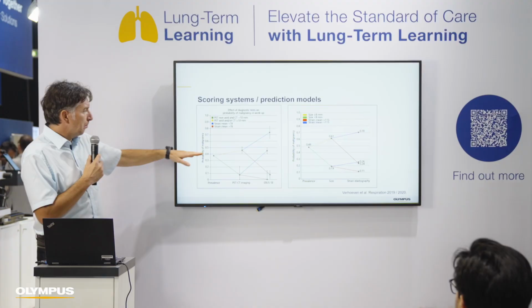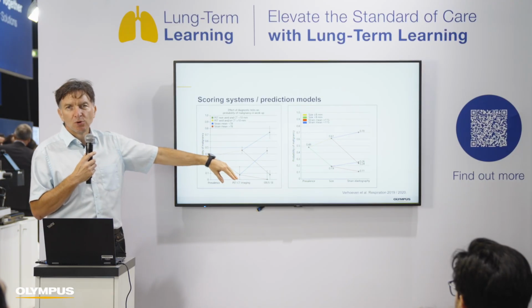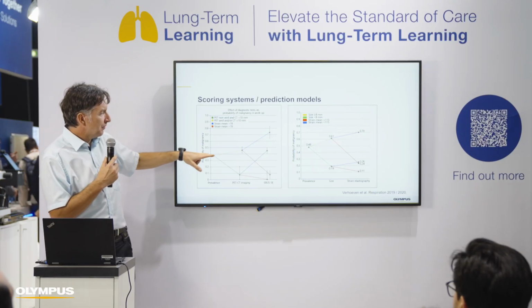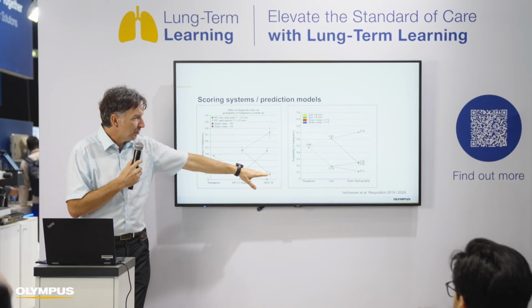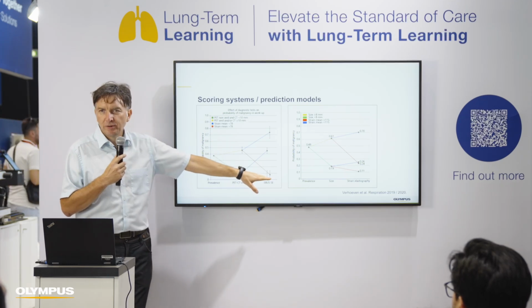So they thought like this. If we have PET-CT, and we have a PET-CT positive lymph node and a PET-CT negative lymph node, then we perform bronchoscopy and make this elastography. And if a PET positive lymph node has a negative elastography, the possibility that it is malignant drops down radically. And if our cytology here is negative, we can believe this result. But if it's positive, it's positive.